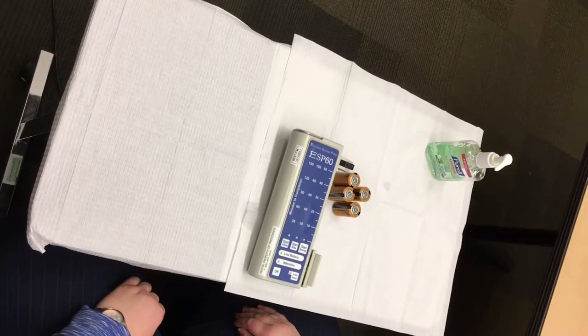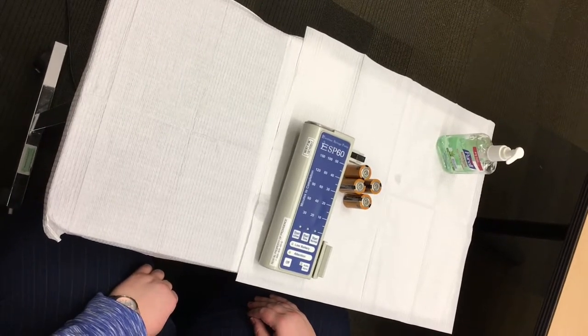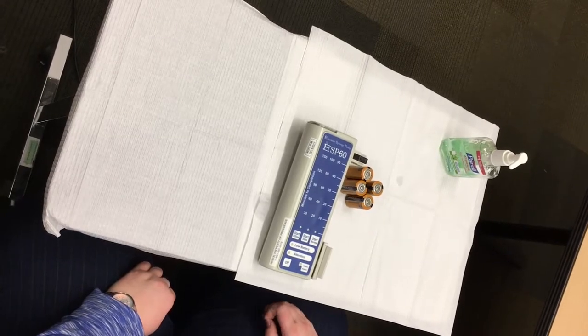The intent of this video is to demonstrate how to change the batteries in your Excelsior syringe pump. Providence Infusion will provide you with all the batteries you'll need. New batteries will last approximately 400 hours.